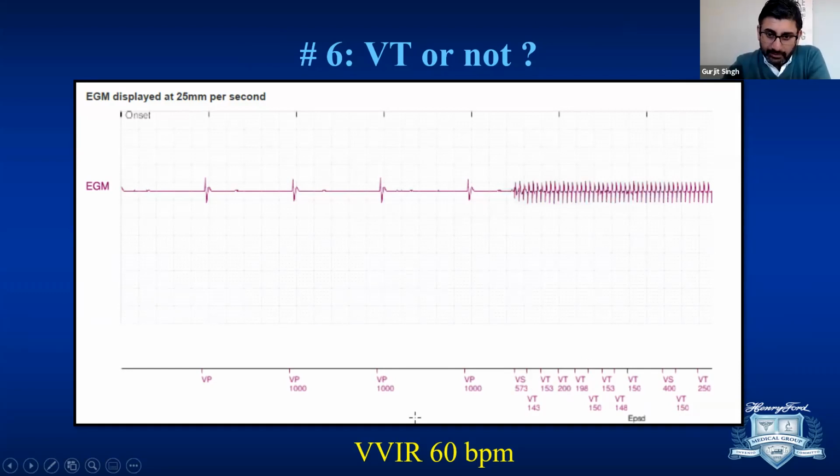Would anyone have guessed? Is this VT? Is it ventricular fibrillation? Yeah. Dislodgement or artifact?